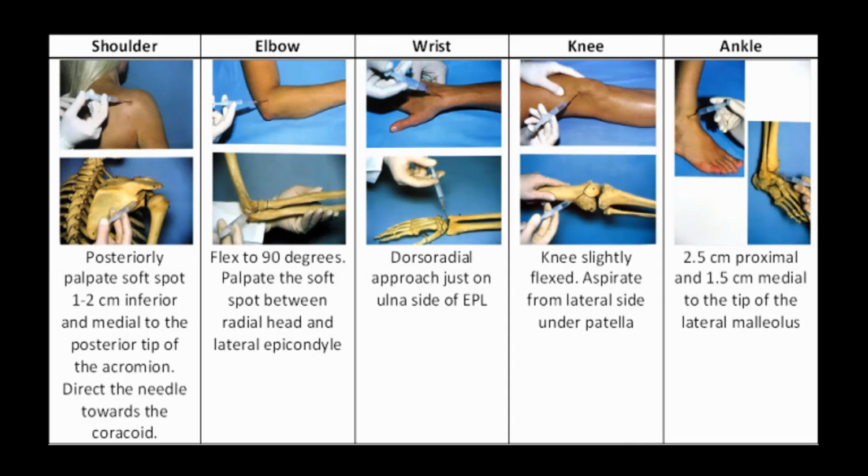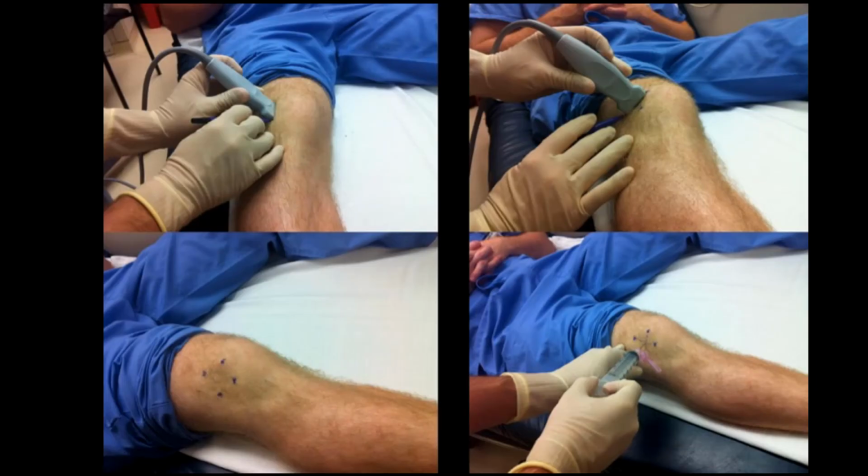needle to go. Look, you can memorize this boring, annoying table, or you can honestly just pull this up before you do an arthrocentesis, stick the ultrasound probe on the joint that you're interested in, and map out exactly where your effusion is and how you want your needle to advance. You can do this in one of two different ways.